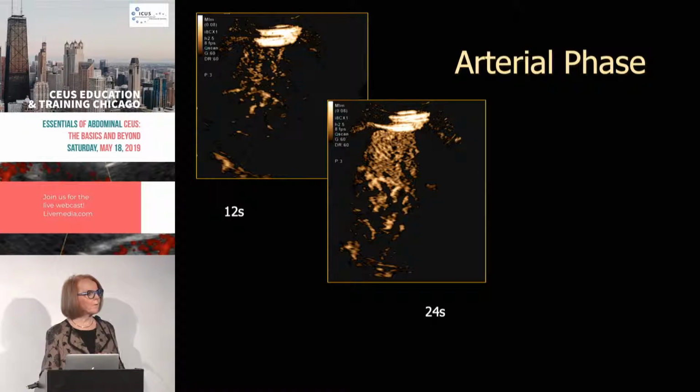Are you in the room with the patient and the sonographer? Were you at the beginning in the room? Because I know I've talked to a number of people who say, well, I want to be there when this is being done. So where do you sit when these studies are done? And where did you sit when you started?